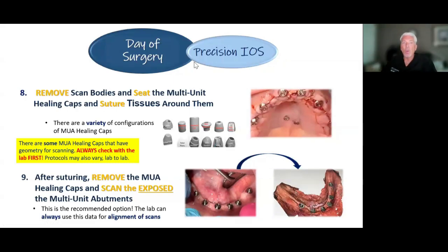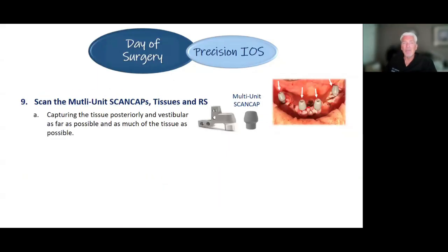Once again, folks, this has all happened on the day of surgery, so there's a lot of scanning going on. Make sure you know how to scan before you do your first case. Practice on models or whatever, practice on your assistants, on each other, what have you.